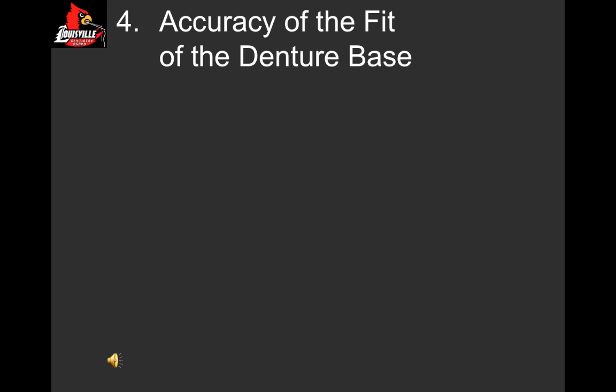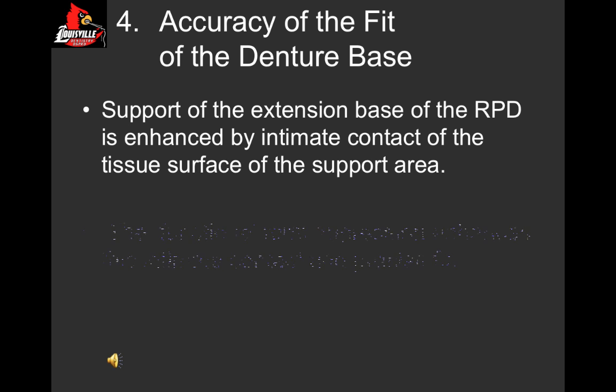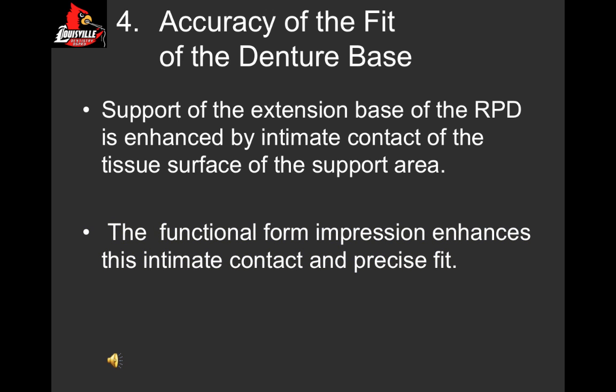Another factor that influences the support of the denture base is the accuracy of the fit of the denture base. Support of the extension base of an RPD is enhanced by intimate contact of the tissue surface of the support area by that denture base. The functional form impression enhances this precise fit.